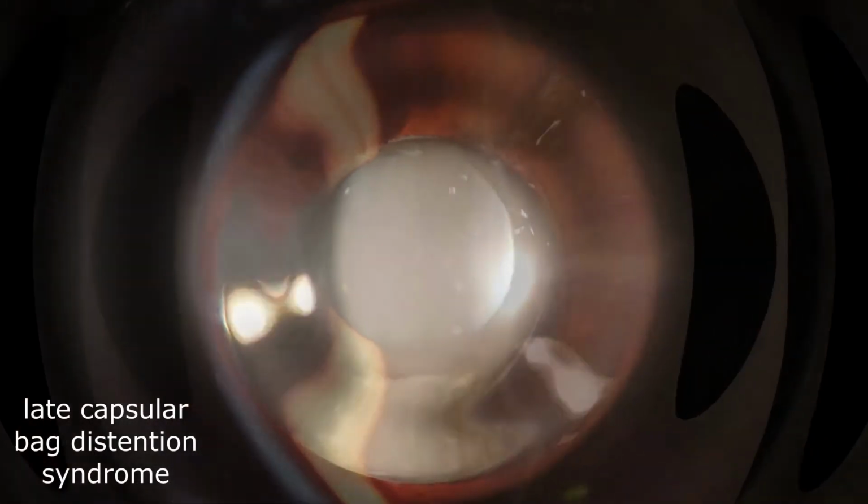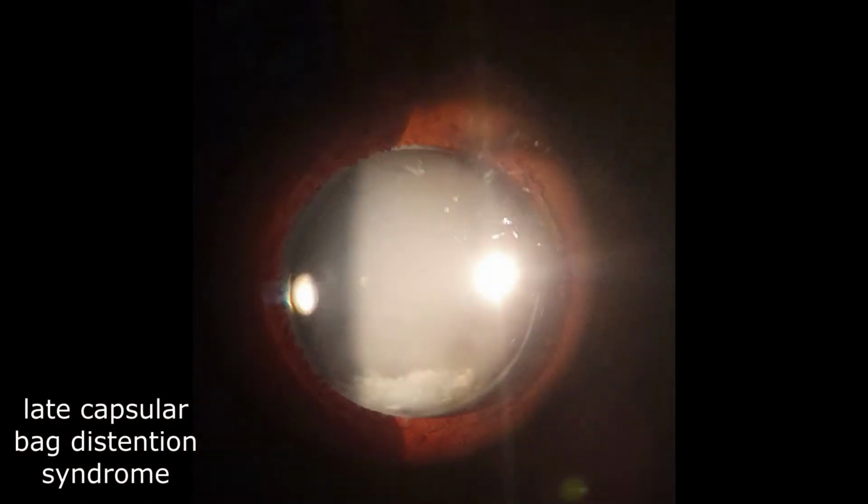In contrast, late capsular bag distension syndrome presents several years after surgery with defective vision, and examination at the slit lamp reveals turbid fluid trapped behind the IOL, distending the capsular bag. Some may have cheesy white material which is derived from the residual epithelial cells. Most of these cases are likely to be early undetected capsular bag distension syndrome.